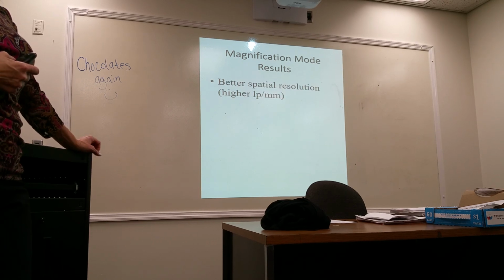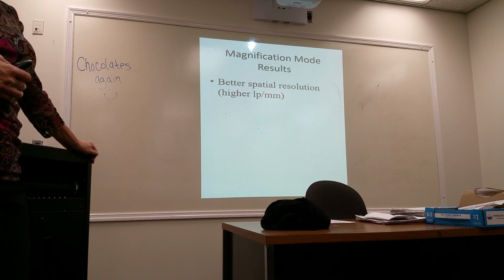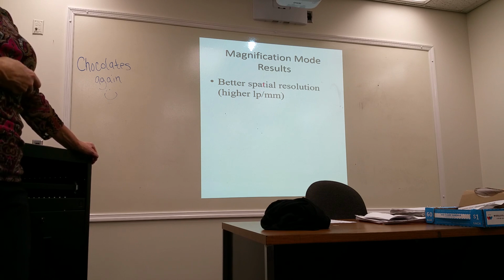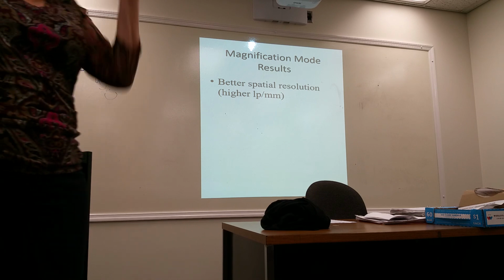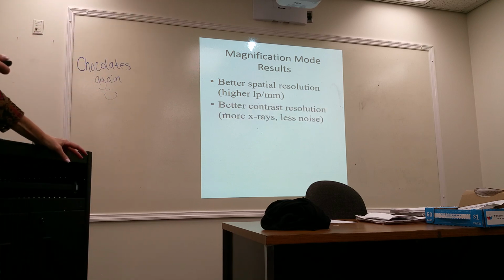Okay, so why do your doctors like the mag mode? I mean, yes, it's increased patient exposure. That's not why they like it, but you get better spatial resolution. You're able to see better. The image is larger. Better contrast resolution. The automatic brightness stabilizer increases, so you have more radiation.